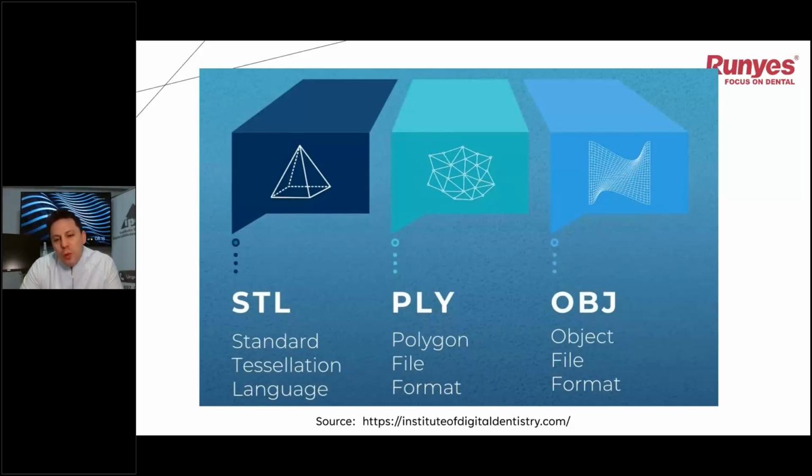And when we work on a CAD software to design a crown or a gum-correcting plastic surgery, we can choose, and it's better for us because we can see the color and the difference, so it's easy for us.